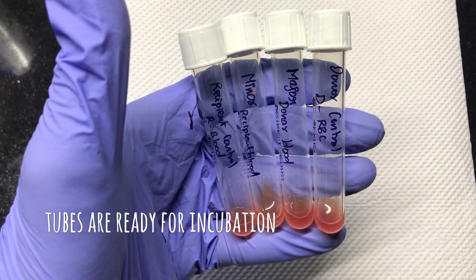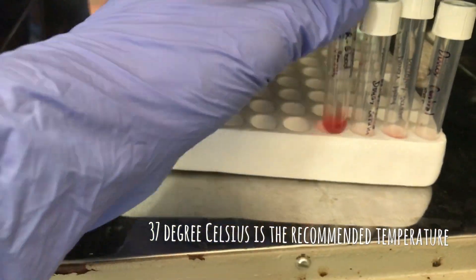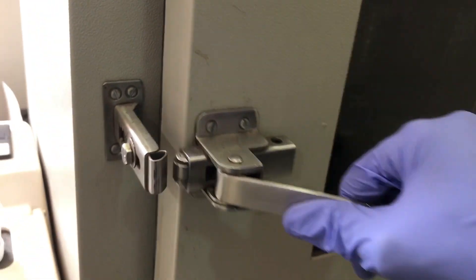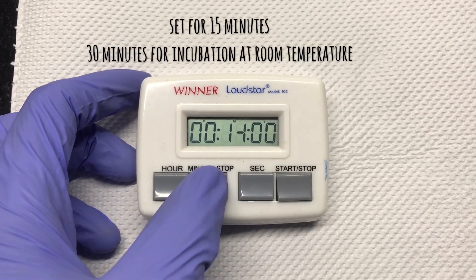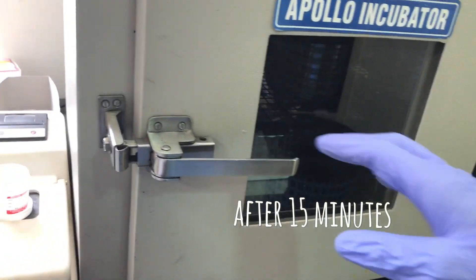After adding donor and recipient samples, it is time for incubation. Incubation is done at 37 degrees Celsius for 15 minutes, or 30 minutes at room temperature. Here I am setting the timer for 15 minutes because I am incubating at 37 degrees Celsius.